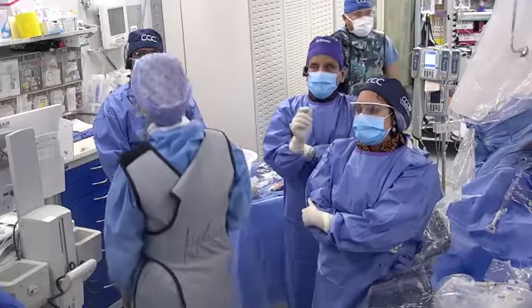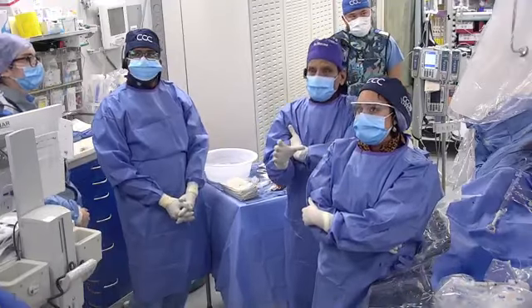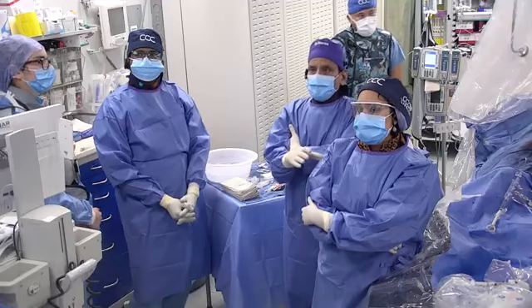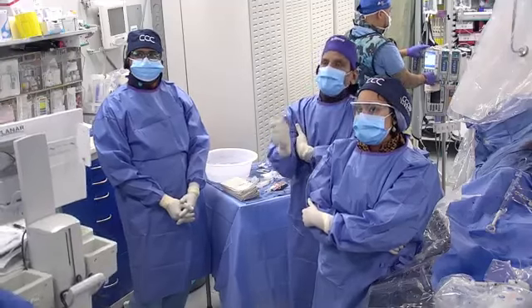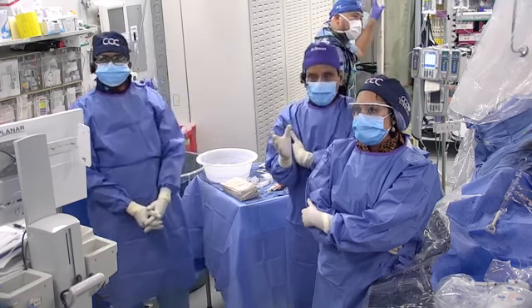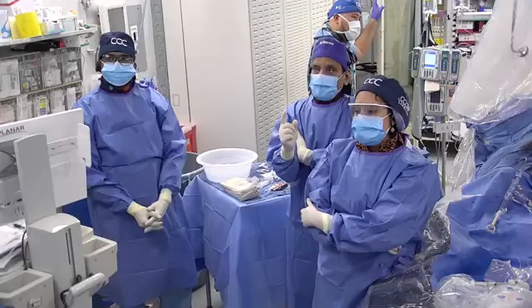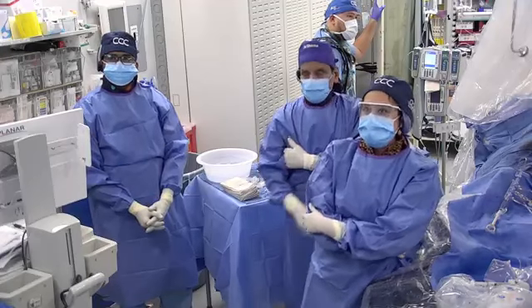Creating bigger vapor bubbles. Now the laser catheter, the machine has gone through major changes. We just acquired the new ones, and so I'm sure those will come to India also. And there's a very rapid setup. In the past, it used to take about 5 to 8 minutes. Now it takes less than 1 minute to be ready. The catheter is the same, but the equipment, the machine, has changed significantly.